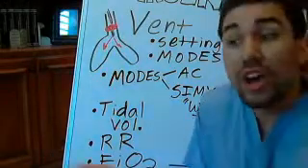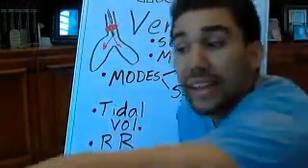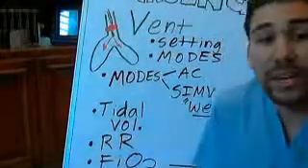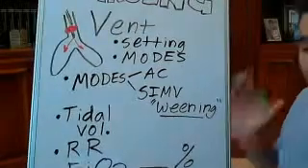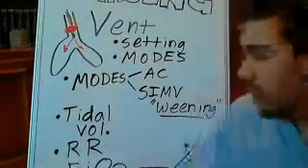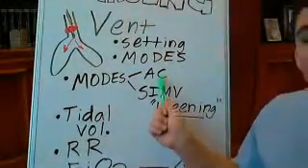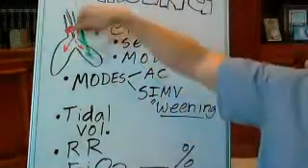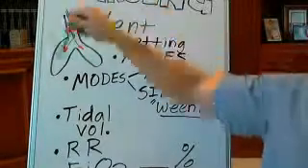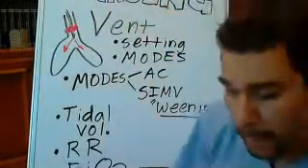Your patient who has long-term respiratory failure, where let's say your patient is brain dead and they can't breathe for themselves, they're going to be on an assist control mode, which is forcing air down into their lungs, making sure that it's breathing for them.